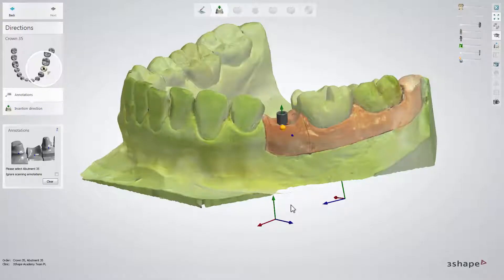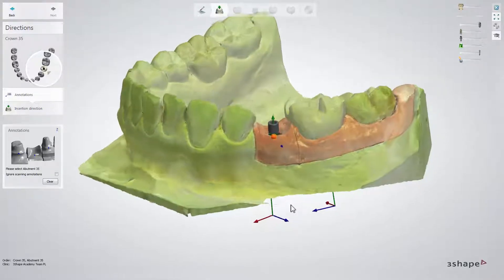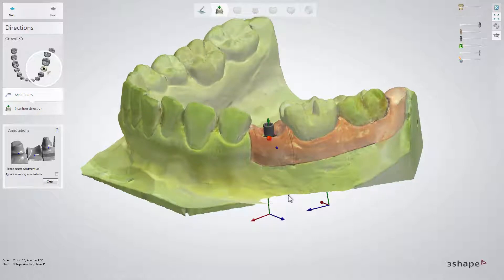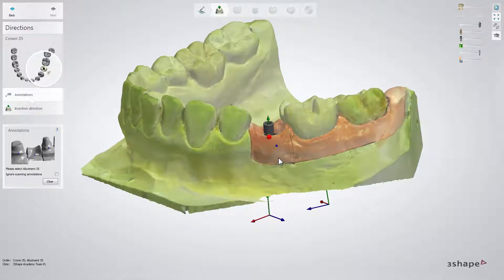When your scans are loaded, place annotations as instructed by the software. For implant cases, place annotations always on the buccal side on the verge of the gum. Then click Next.